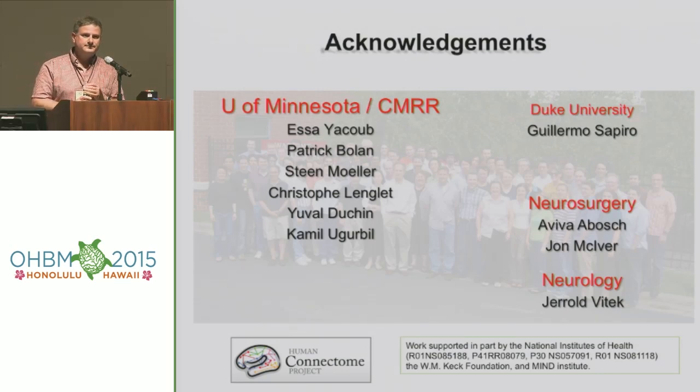Sorry, just a basic question. You showed both spin echo and gradient echo fMRI. I thought in fMRI you want to catch the mesoscopic part of R2 star, so R2 prime, so to speak. So why do you want to do spin echo then? The whole idea with spin echo is that it's less sensitive to the large draining veins and more sensitive to the small capillaries. Right, so it has some admixture from R2 prime as well. Otherwise you wouldn't see anything.